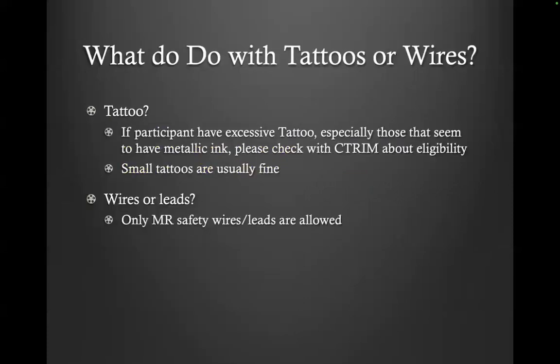And what do we do with tattoos or wires? If the participant has excessive tattoos, especially if they seem to have metallic ink, you should talk to us to check eligibility. Small tattoos are usually fine, but our practice has been to ask the subject to be very vigilant about their feelings, and if they feel any burning anywhere, they should let us know.